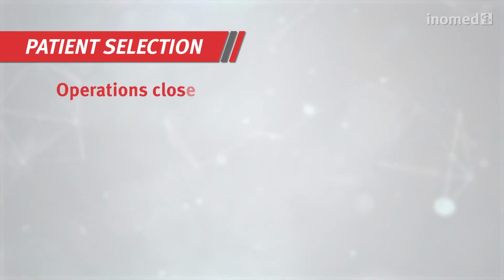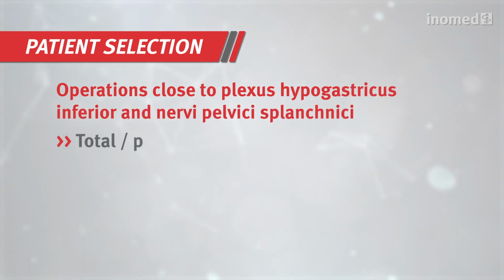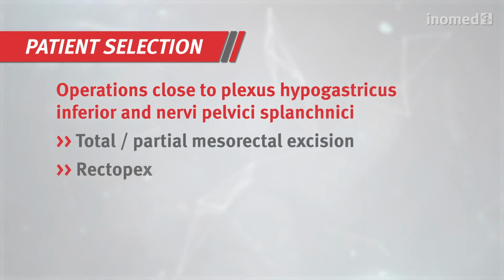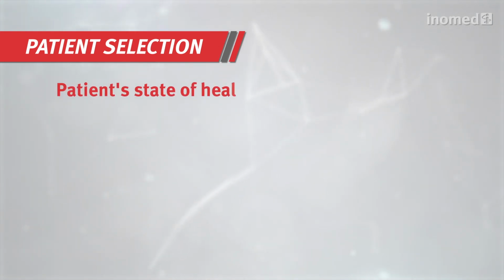Not every patient is suitable for the application of pIOM. The technology can be used during operations close to the plexus hypogastricus inferior or to the nervi pelvici splanchnici. Furthermore, nerves can only be monitored when they are functioning.